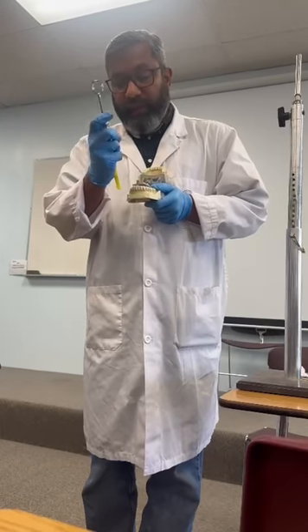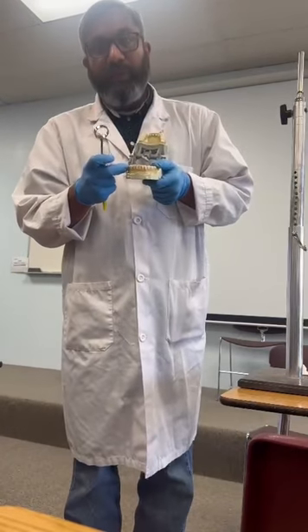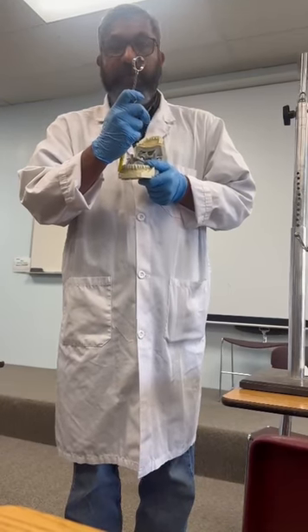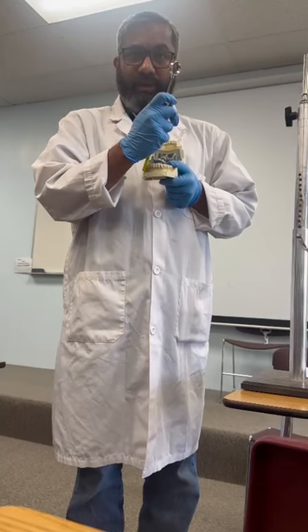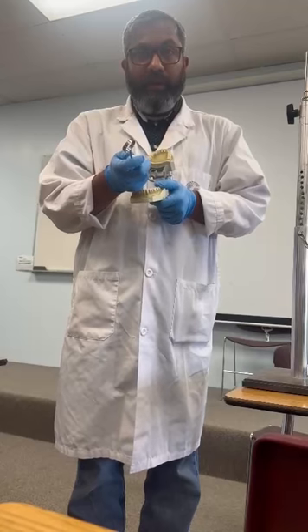If we give the injection in the mucobuccal fold like here, in between the two premolars, that will be your mental block or the incisive block. And we give the inferior alveolar nerve block here.